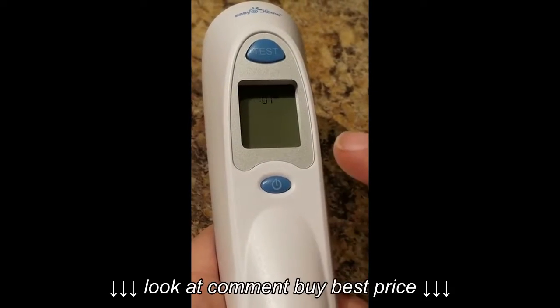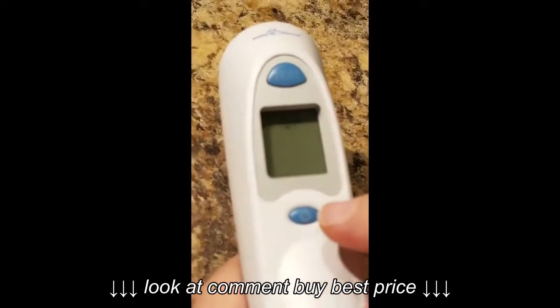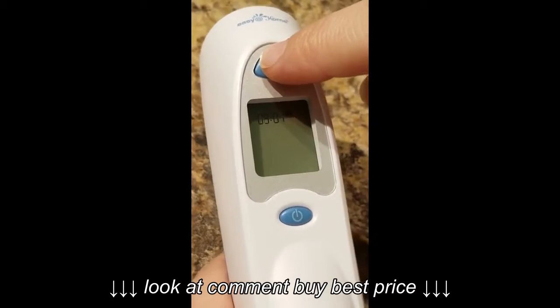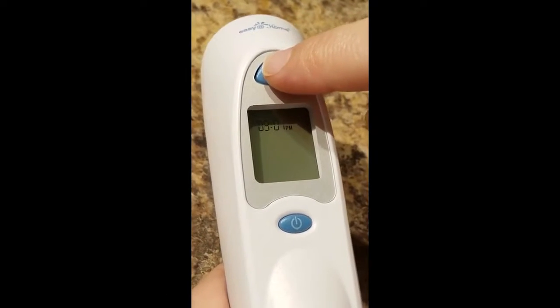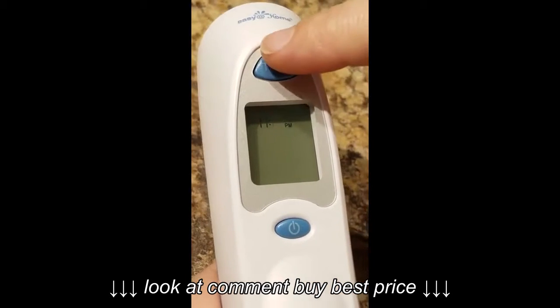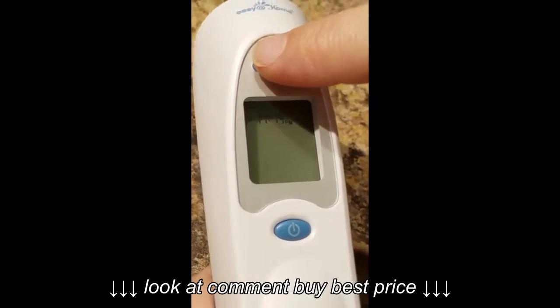up the time. And the time is now 11:32. And so it's 11:32 p.m. So you'll hit the test button until you get to 11. It's on AM, so I'll have to go through and go to 11 p.m. And then I'm there at 11 p.m. and now I'm going to hit the power button again to hit the minutes. So it's 11:32.